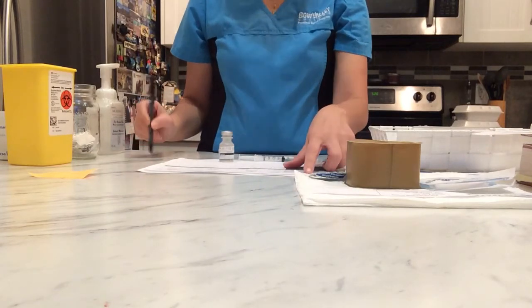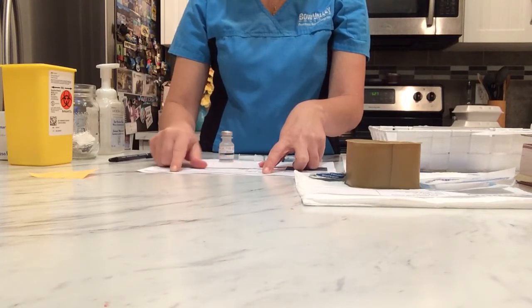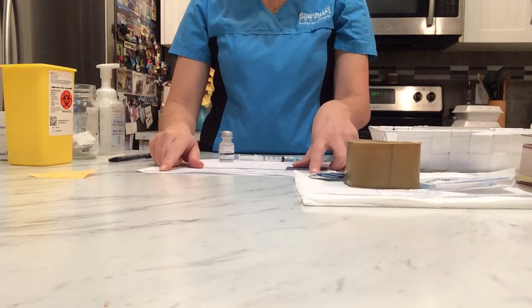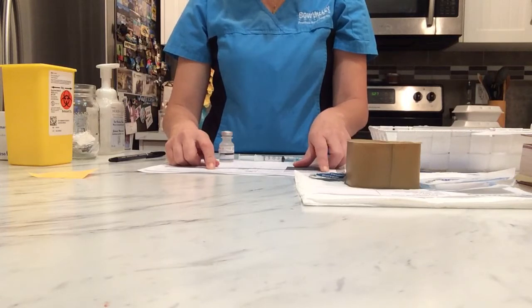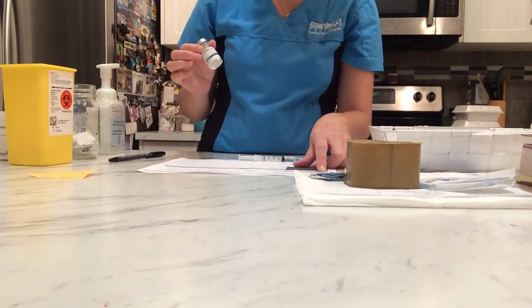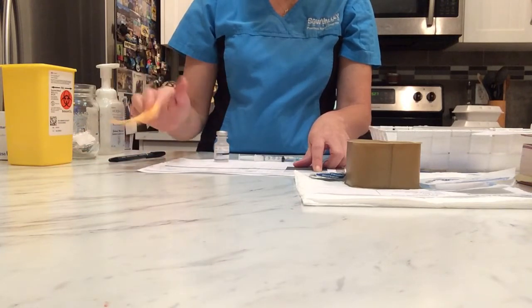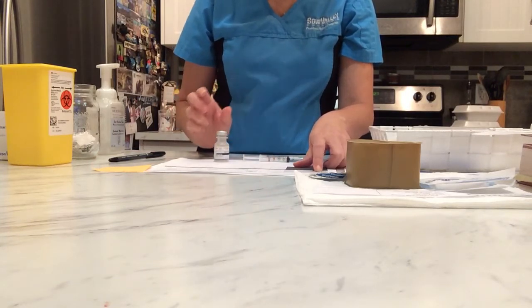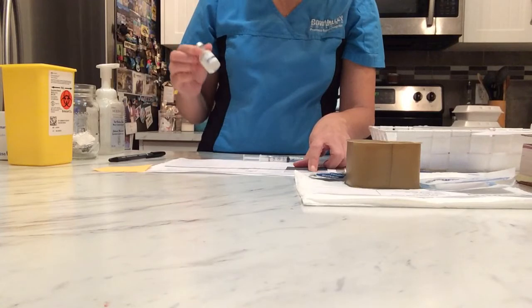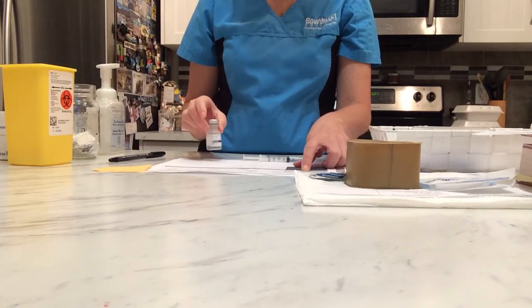So I have Crash Auto, male, hospital ID 121-2393, date of birth 1960, February 20. Today's date is November 30, 2020, and it is 12 o'clock. And the medication is Ketorolac, 30 milligrams per 1 ml. I did my med math, it's 30 milligrams per 1 ml, and I withdraw 1 ml every 6 hours intramuscular. Here it says for intramuscular route for 5 days while awake, and then reassess.